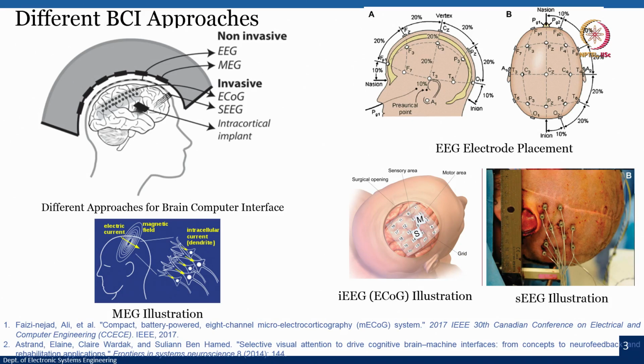In another way, if you want to remember: F is frontal, P and O are on the back side, and C is in the center. In that way it is easier to remember. The front side we call nasion, and the back side we call inion.